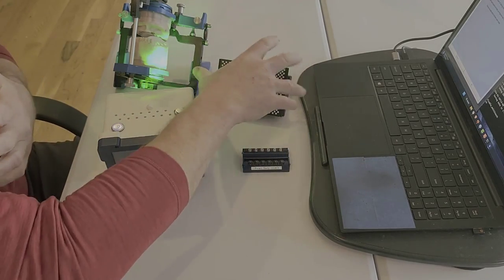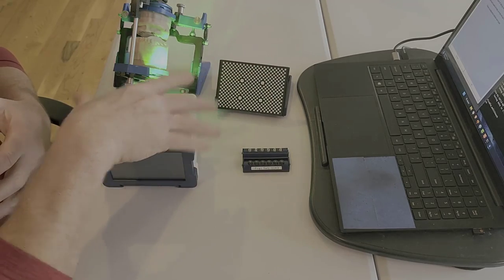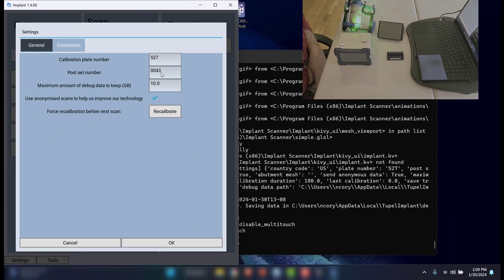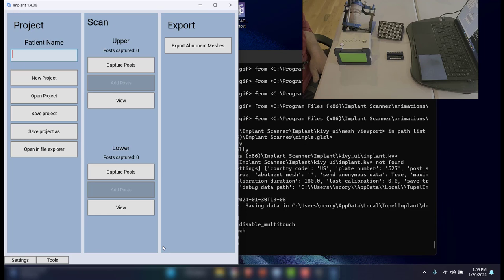And it's got this little holder where you can actually stand it up and make it easy for the scanner to see. You're going to input your post set number, and these are all things you'll just have to do the first time you set it up. And because I've already used the scanner today, it probably wouldn't force me to recalibrate, so I'm going to make it recalibrate when I first launch the case, just so that you can see that process.